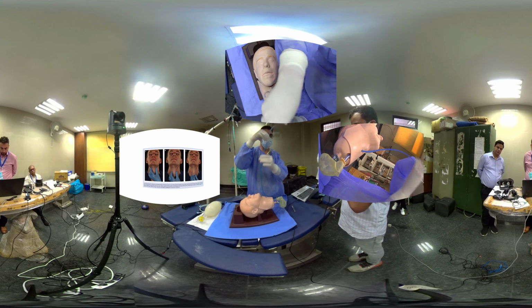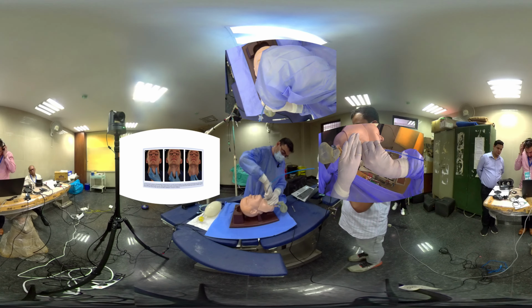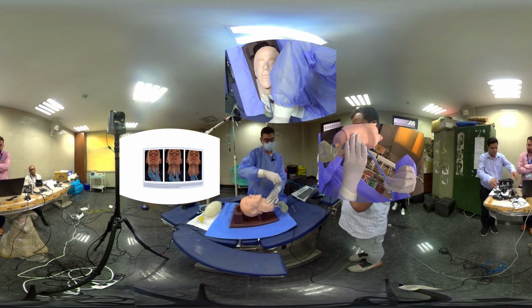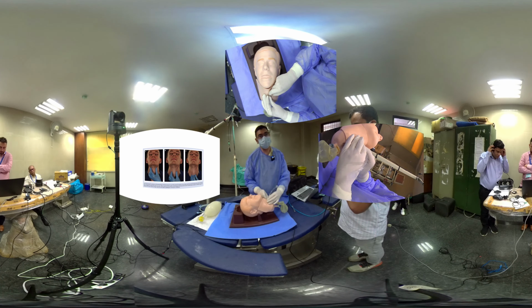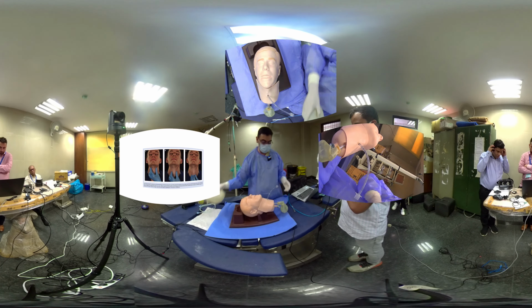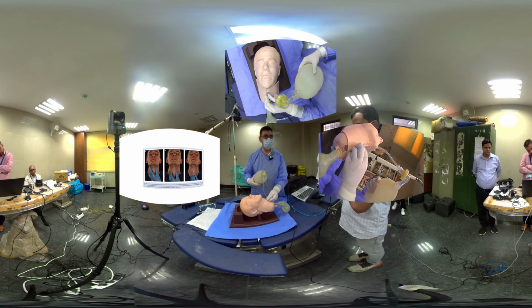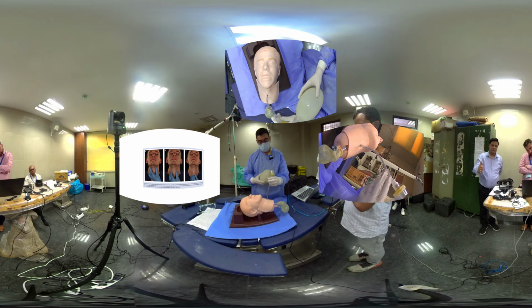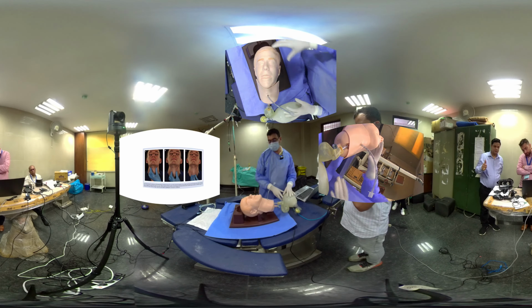Once I enter, I have to go in a twisting movement. The twisting movement will insert the tube into the trachea. Once it's around 5 to 6 centimeters inside the trachea, I remove the bougie and I inflate the cuff of the endotracheal tube, and then I check the ventilation to see whether the tube is there or not. I connect it, and you can see when I inflate, the lungs are getting inflated, right. So this is how you do it, and this is a very important step of rescue in case of failed oxygenation. Thank you.